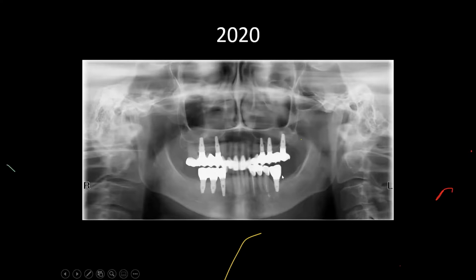Okay, now if I find that I'm losing more bone for any reason, then I will say, well, looking on the right side, they have the implants, maybe it's loading, but on the other hand, you look at the middle implant, there's a bit of bone adaptation around here. There's no bleeding here, it's bone adaptation. This bone can go up and down, we don't really know. Because it's not a tooth, right? This is an artificial device. Implants are an artificial device.